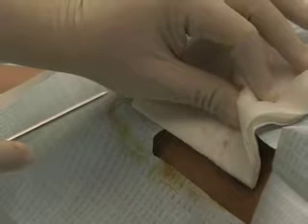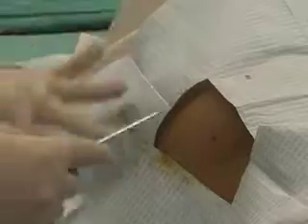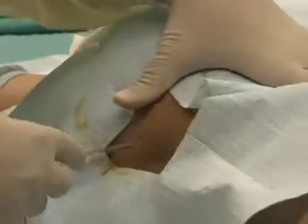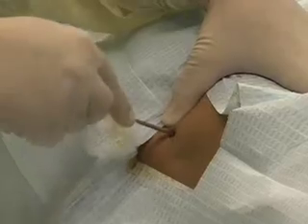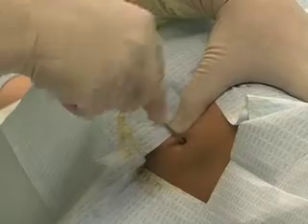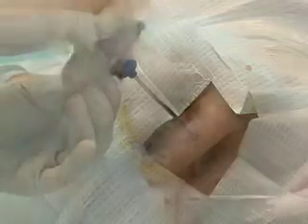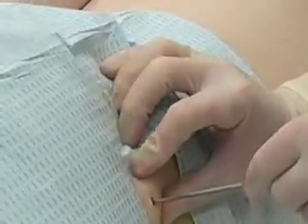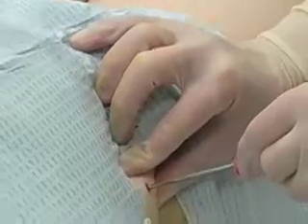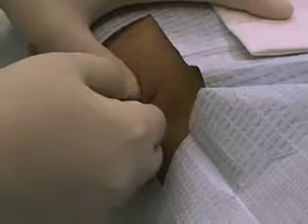A bone marrow biopsy is often done following a bone marrow aspiration. Maintaining sterility, obtain a bone marrow biopsy needle. Holding the needle between your palm and index finger, insert the needle into the patient's skin and advance until it touches bone. If an aspirate has been performed, the same entry site through the skin may be used for the biopsy. However, a skin incision may be indicated if only a bone marrow biopsy is being done, or after an aspirate to allow for entry of the larger biopsy needle.